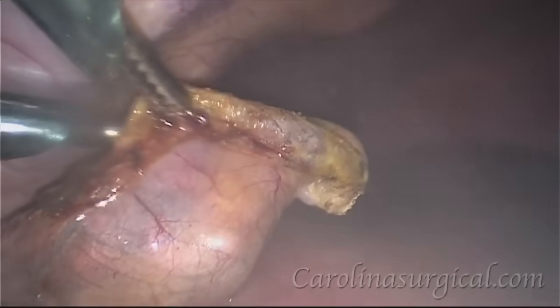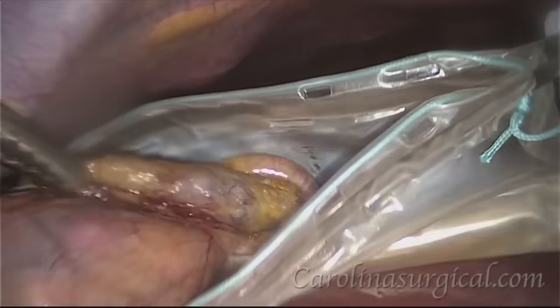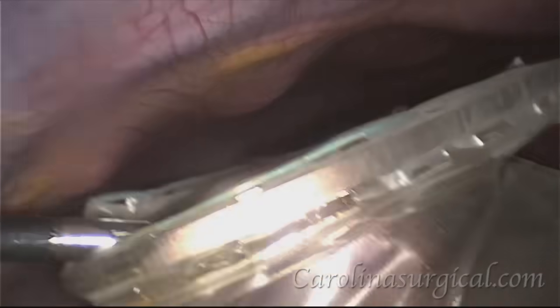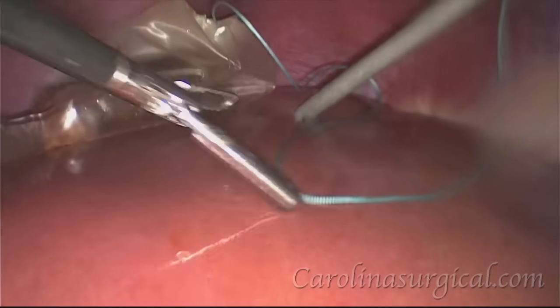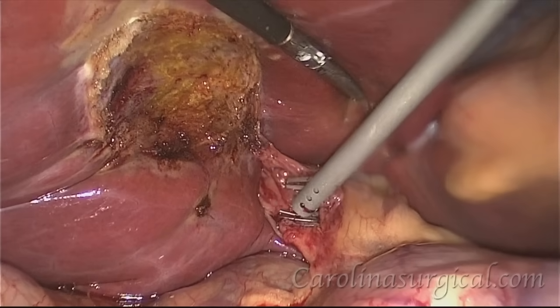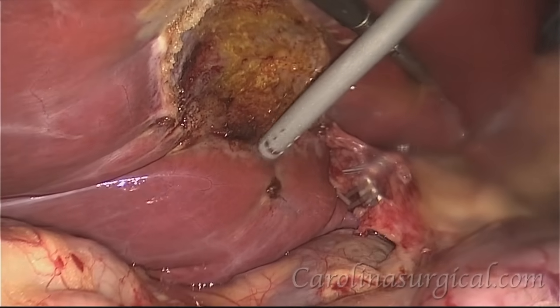And there we have it. Now that the gallbladder has been detached from the liver, we place it in this bag so that we can remove it from the body. But before we do, we'll take one more look under the liver just to make sure that there's nothing bleeding and that our clips are in good position.